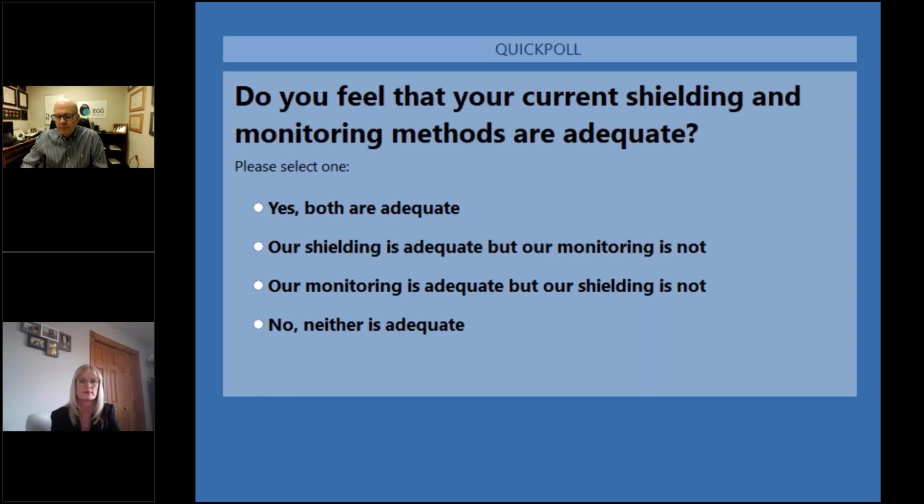Dr. Wilson, are there any additional comments at this time that you would like to share with the audience, you or Jackie? Well, one question I get sometimes from RSOs, interventional radiologists and radiation physicists is about the accuracy of these solid state meters. A couple of weeks ago, we did an extensive validation against the model that I showed you, which is pretty robust, using an ion chamber compared to each of these, the I3 and the X2, which is kind of the survey meter.